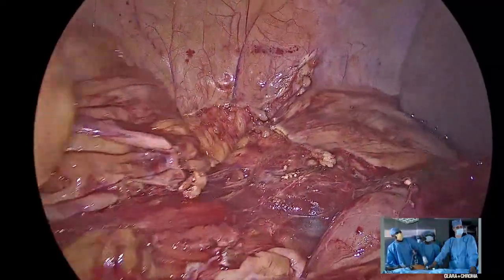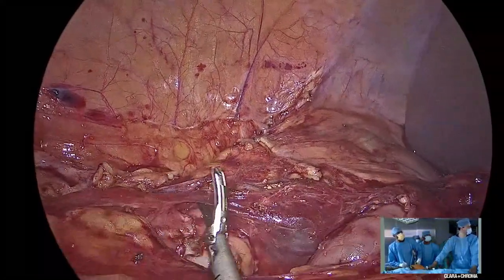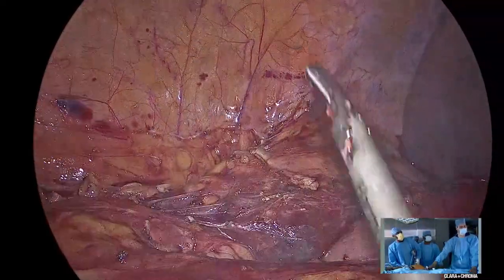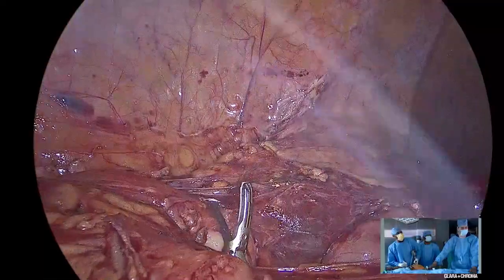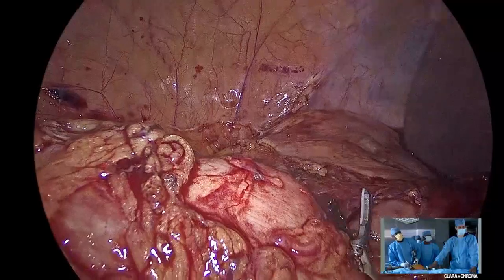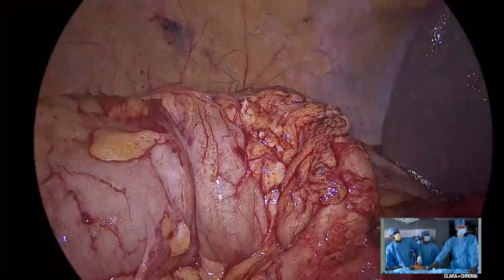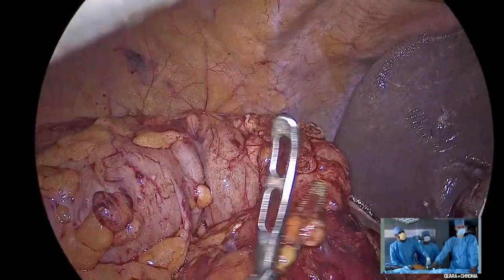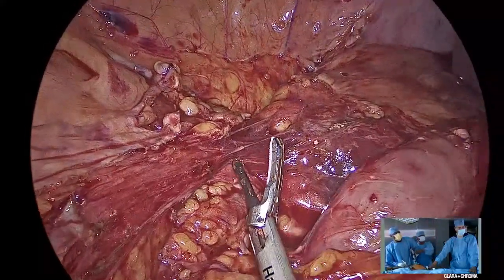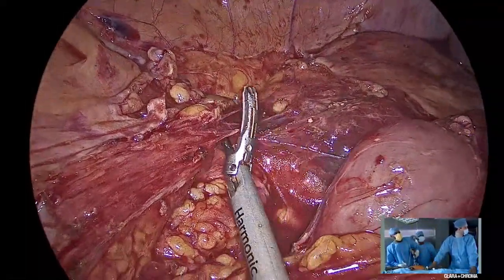Yeah. In fact, some people would probably keep it the opposite way. Yeah, I agree. So what I do is I go in first and then I lift it up that way, because you never know. I mean, the IVC is not far from here. If you just take this adventitia away, you should be able to see the IVC. So Jameel, basically the rules don't change, the basic structure like look, hook and cook. Correct, look and cook. It's the same. Absolutely, sir. A great one, sir.